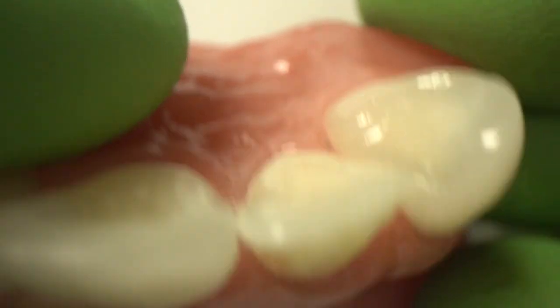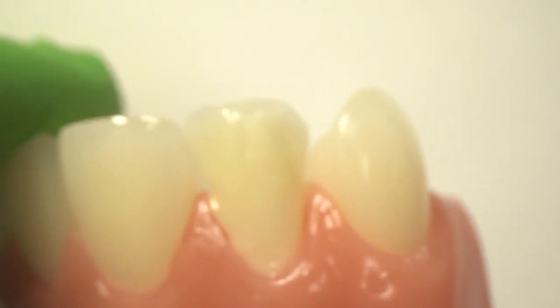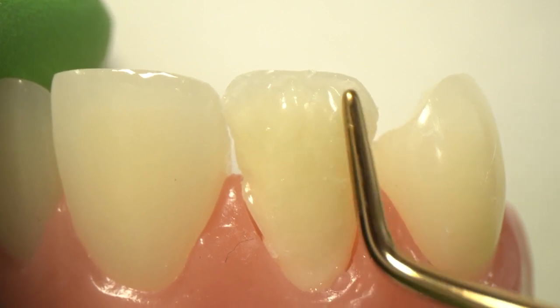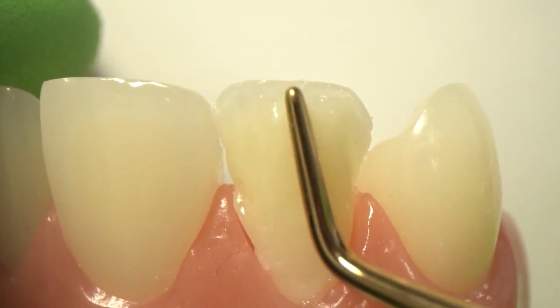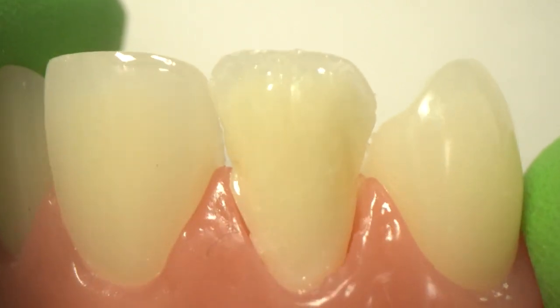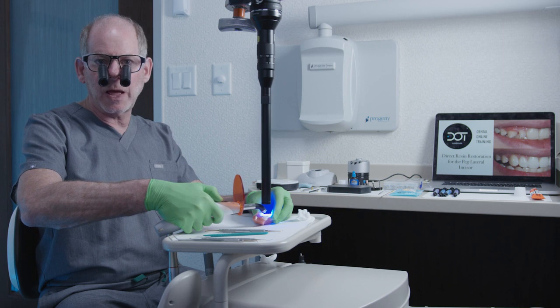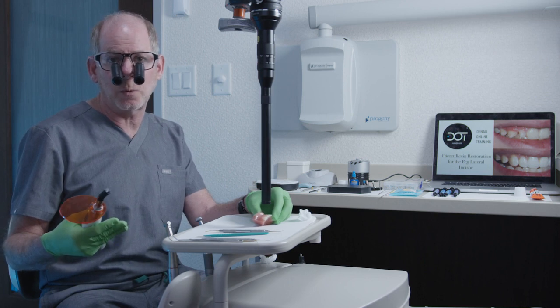Looking from the incisal, making sure we're leaving room for the microfill, then blending it into the tooth structure to create as smooth a surface as possible. Once you're satisfied with that, go ahead and cure — I'm going to cure this for 10 seconds. Build your mamelons, block out, but remember: leave room facially. Don't build over the top of that tooth structure where we need the microfill.